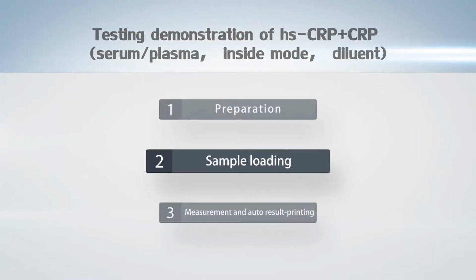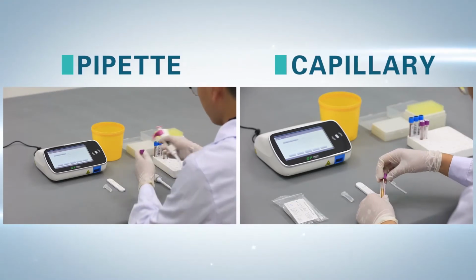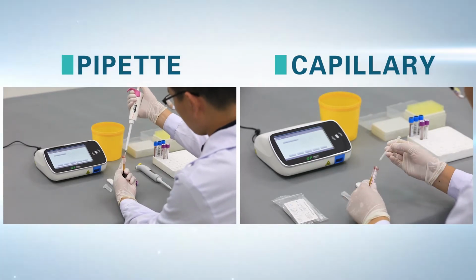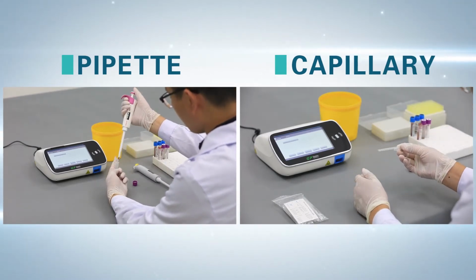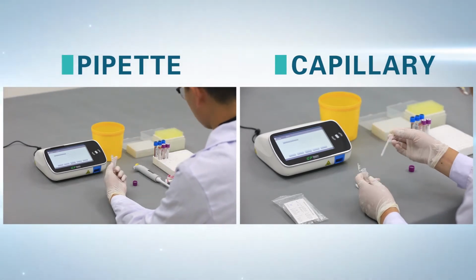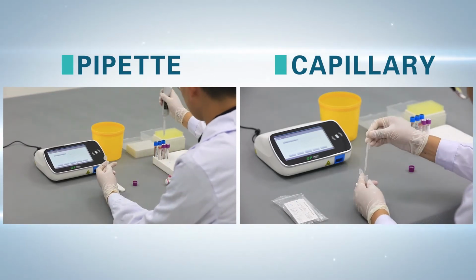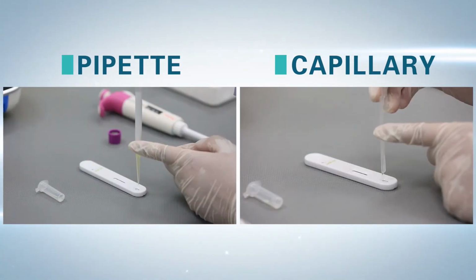Step 2. Sample loading. First, take 10 microliter sample with pipette or capillary and mix it gently with 1 milliliter diluent. Then, take out the HSCRP test card and add 120 microliter diluted sample on it.